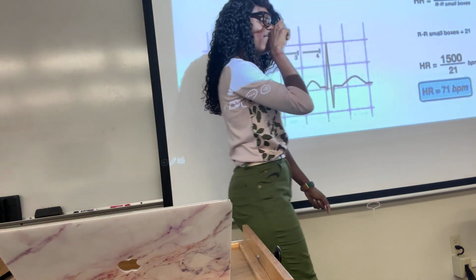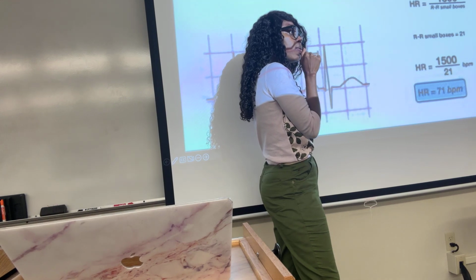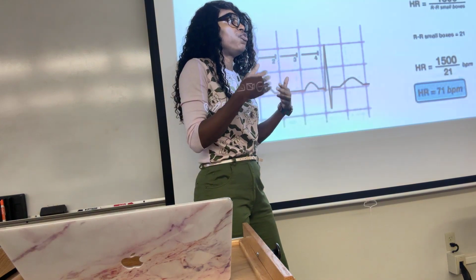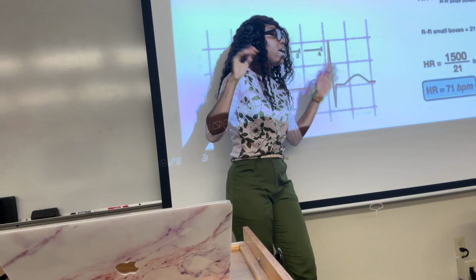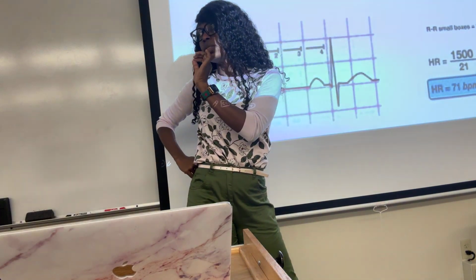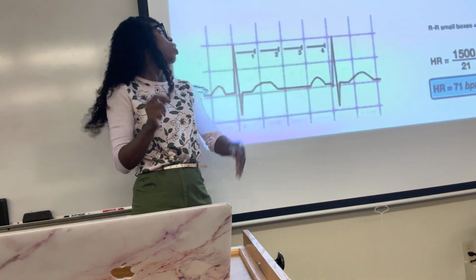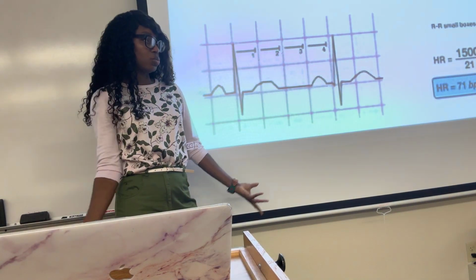Okay. I guess my question is, can you use either the 1500 or the 300? Yeah, you could use either one. It's up to you what you feel comfortable with and what you remember at the time, right? They say that the 1500 rule is more accurate, more precise, right? Because we're doing like 21, 22, 24. We're eyeballing it a little more closely. Whereas the 300 rule is more like the average, the range, okay?